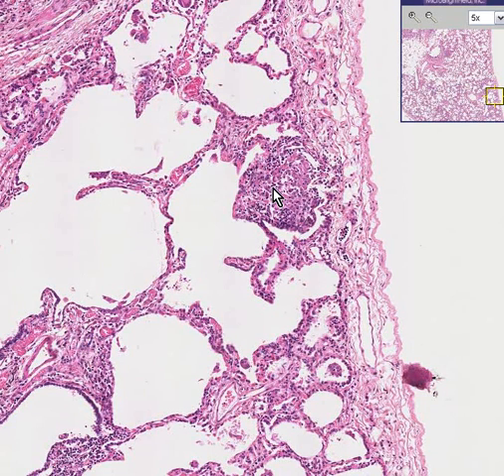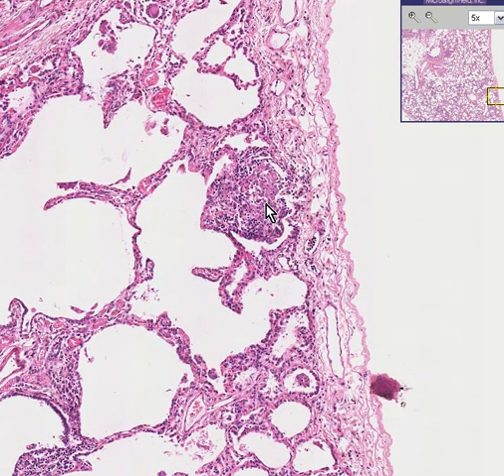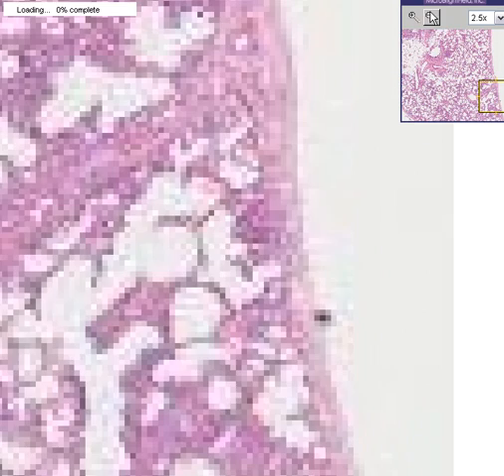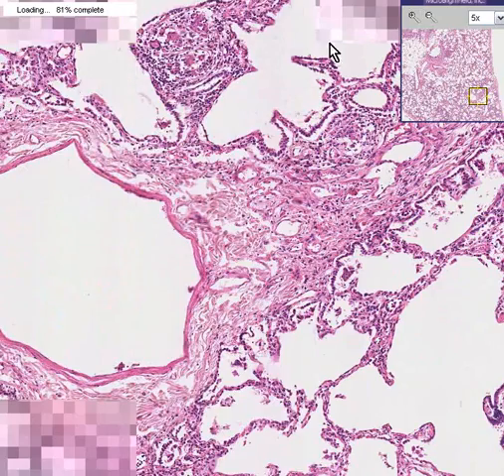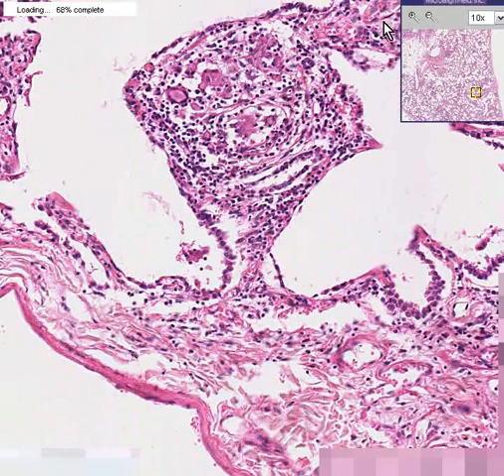But the classical picture for sarcoidosis would look something like this, because in some of the other fungal and TB diseases, the granulomas would be expected to become a little bit necrotic in the center. Classically, sarcoid is non-caseating granulomas. Of course, it's not limited to the lung, and the granulomas of sarcoid could be in many places. But this is a classical sarcoid granuloma.